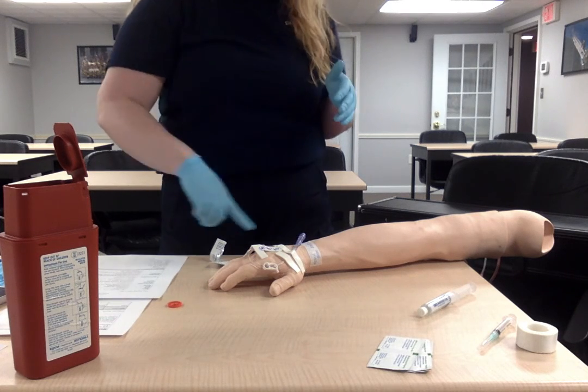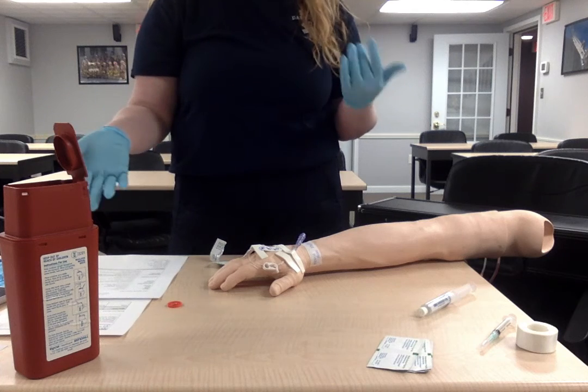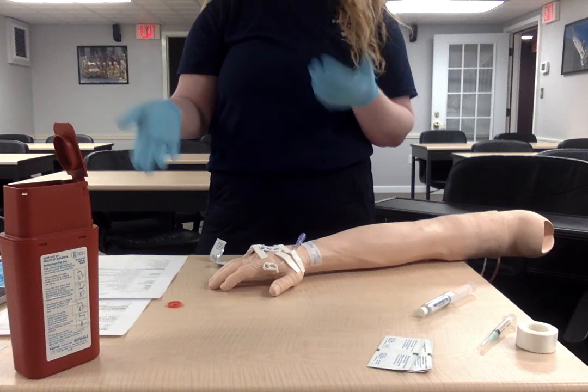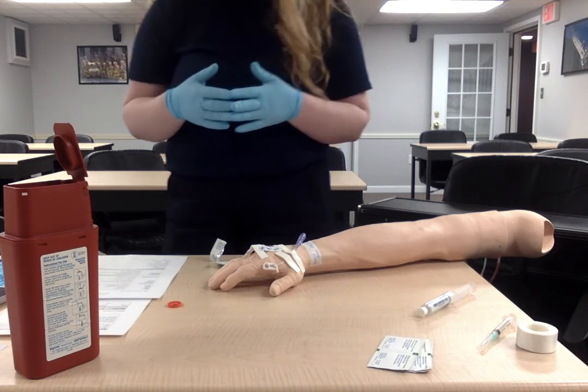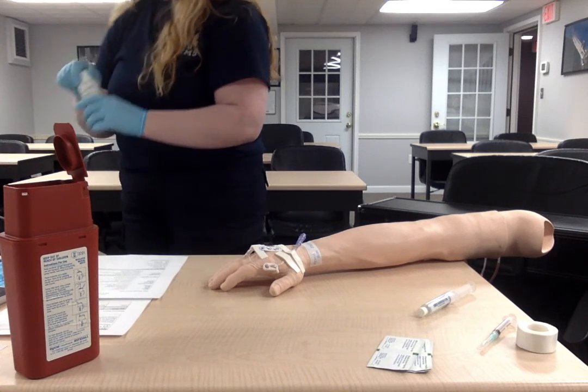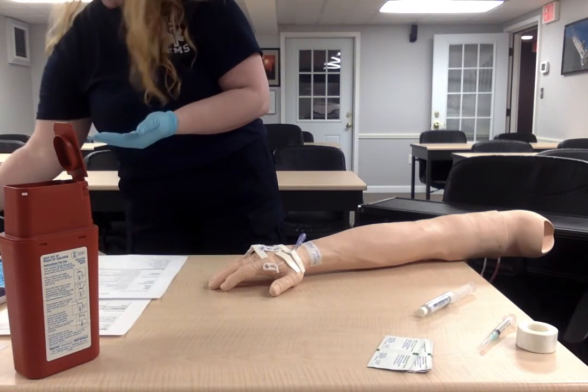We're going to make sure that we're continually looking for redness or swelling, and make sure our patient knows that they need to continually check if anything's uncomfortable, and what to look for as far as adverse reactions or anything like that. So we can discard all of our supplies at this point. We're going to perform hand hygiene.